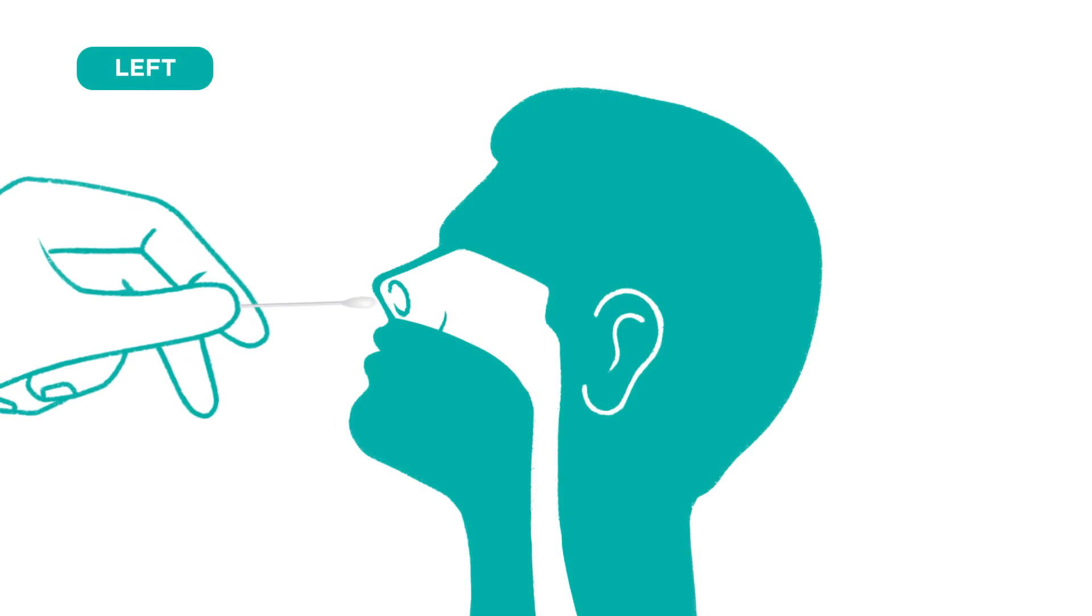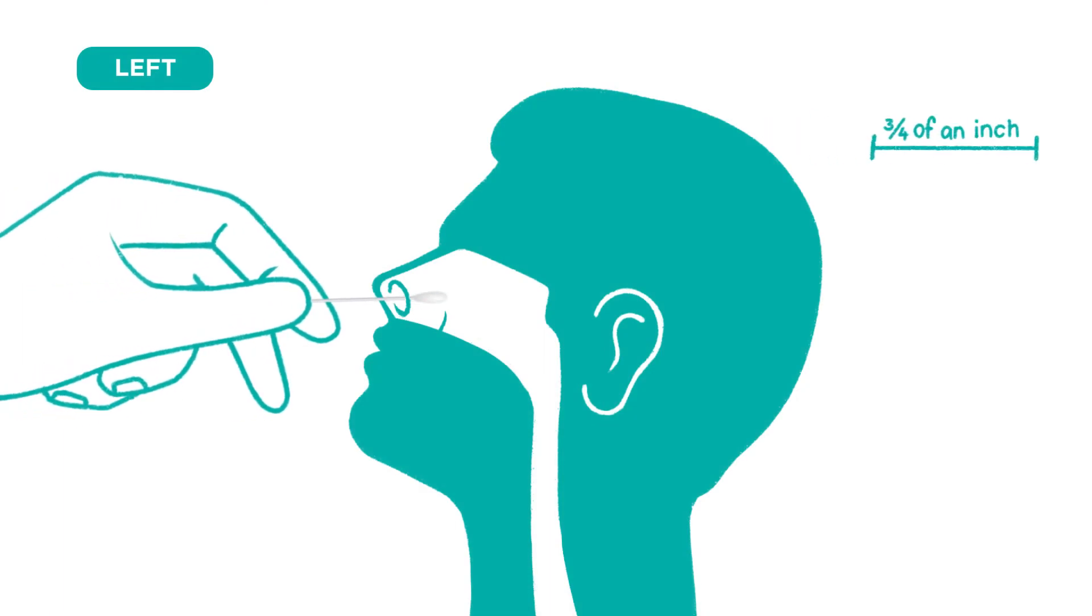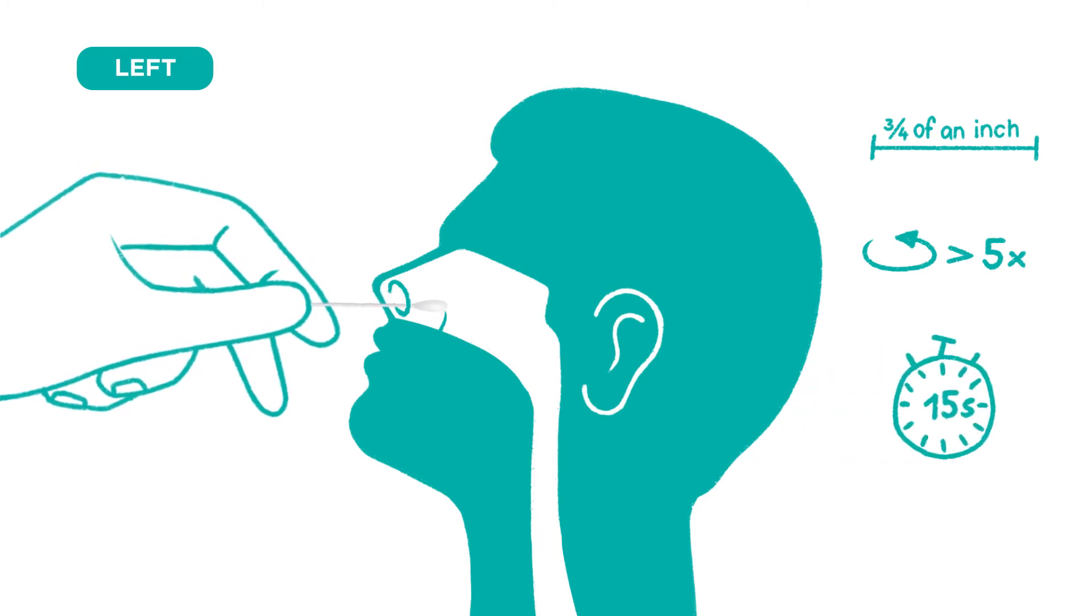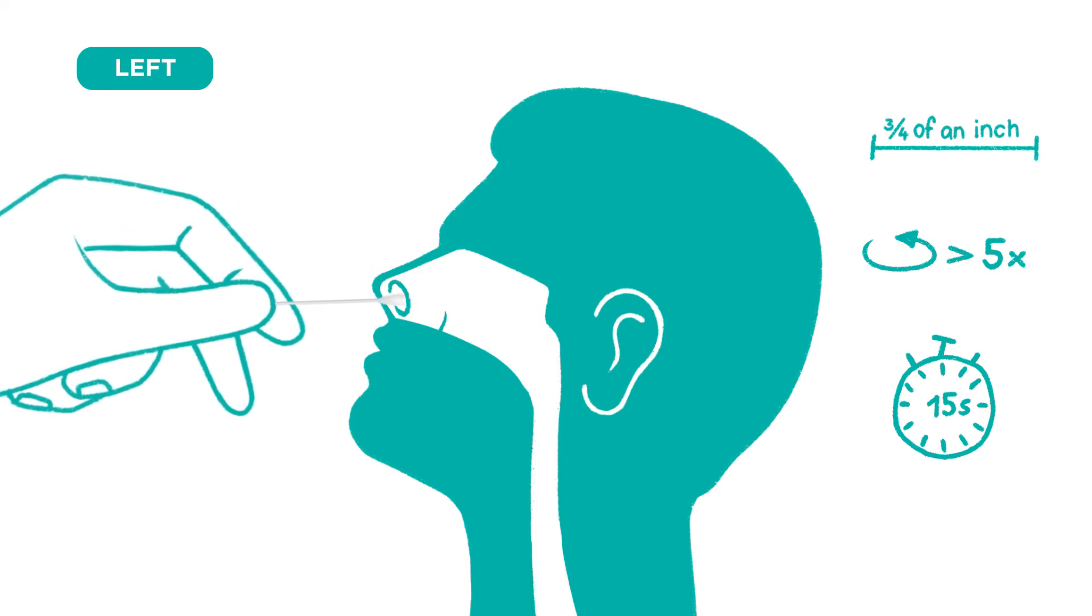Gently insert the swab no more than three-quarter inches or two centimeters into the left nostril. Then slowly rotate the swab at least five times in a circular path for 15 seconds. Once complete, carefully remove from the left nostril.